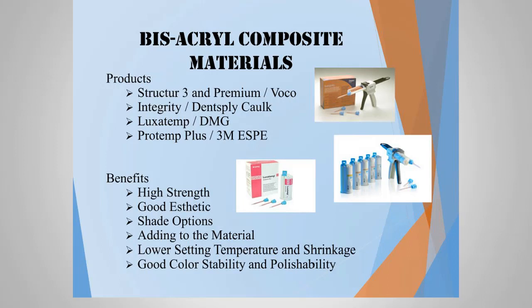The bis-acryls, again, I mentioned there's many out there. Structure 3 by Voco, Integrity by Dentsply, Pro-Temp Plus by 3M. They all are good materials. You just have to find a material that you can use and works well in your hands, but they all have good strength and aesthetics. Most of them come in different shades, so that shouldn't be a problem in terms of matching them to the patient's liking.